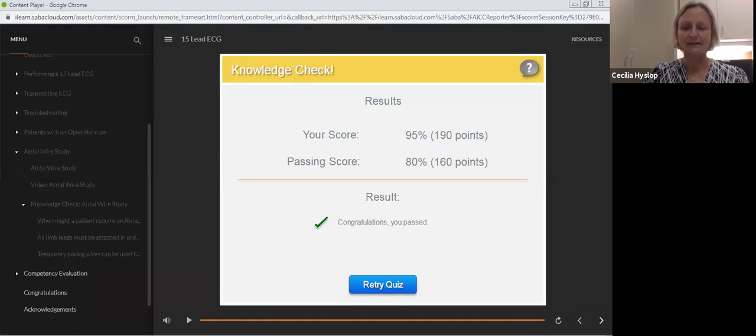All right. So I think that's the main things that we want to communicate to you in terms of taking 15 lead ECGs. And the main pieces are ensuring that we have good placement of our electrodes, that we wait for a good ECG, and that's the one that we want in the patient's chart. And we think about all the troubleshooting that we need to do in order to minimize interference. That if a patient is dextrocardia, it's Sick Kids, we basically reverse all of the leads now. Again, that might be different where you work.